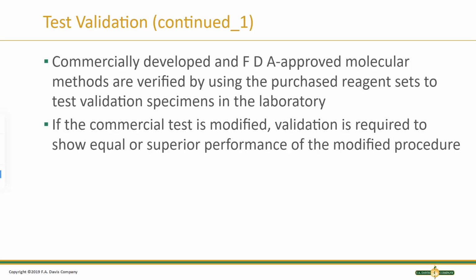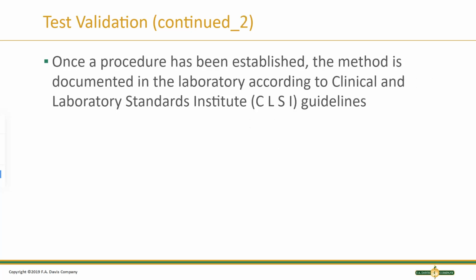Commercially developed and FDA-approved molecular methods are verified by using the purchased reagent sets to test validation specimens in the laboratory. If the commercial test is modified, validation is required to show equal or superior performance of the modified procedure. So you can't just change up a procedure and expect to report out the results without answering to the validation of that new procedure. Once a procedure has been established, the method is documented in the laboratory according to CLSI guidelines.